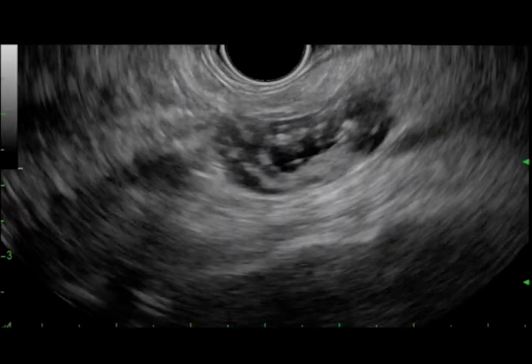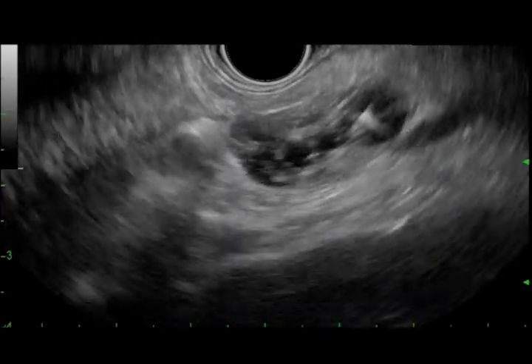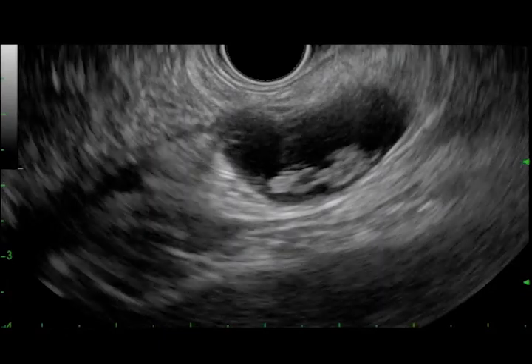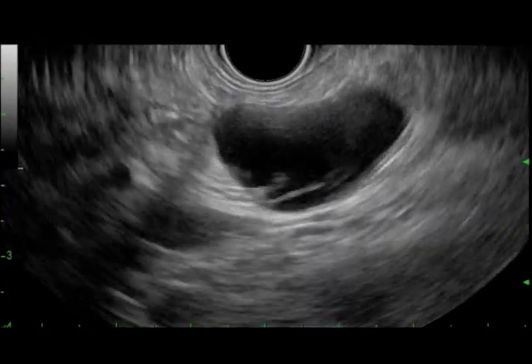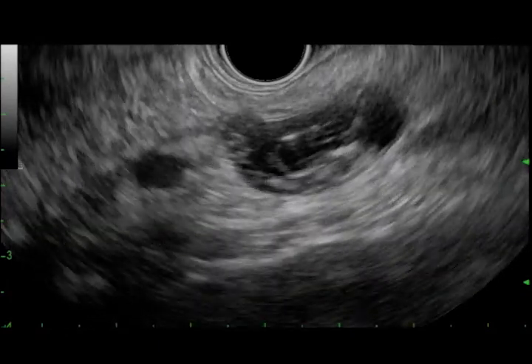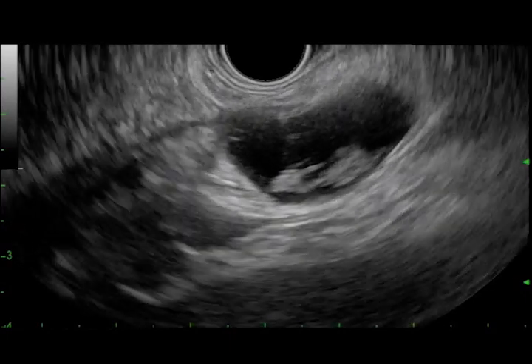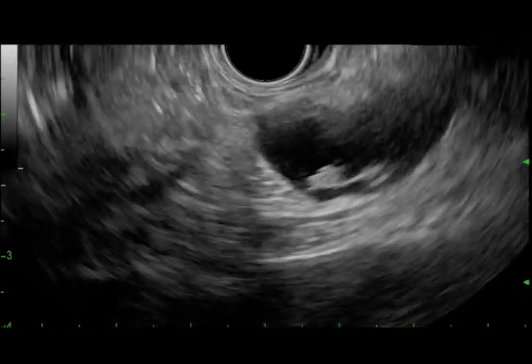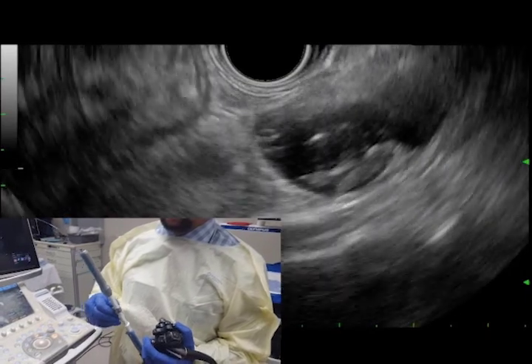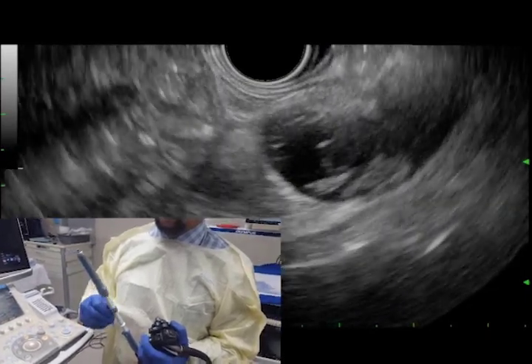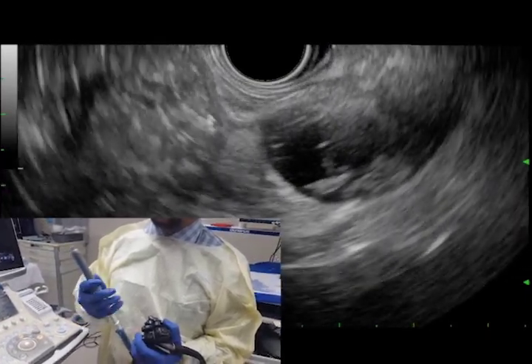The following is a case demonstration of a cyst wall biopsy. Here you can see a 1.5 by 2 cm unilocular cyst with what appears to be some debris within the cyst. First, the cyst is punctured with a preloaded 19-gauge FNA needle.